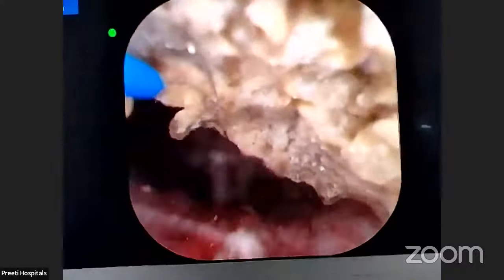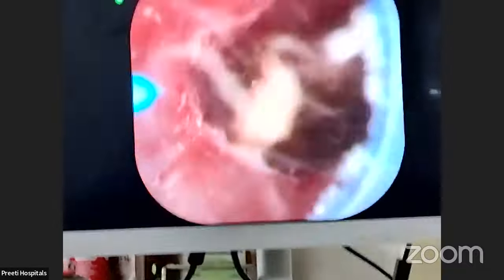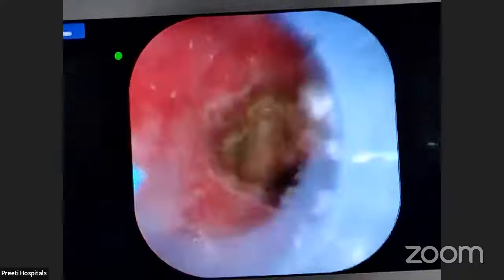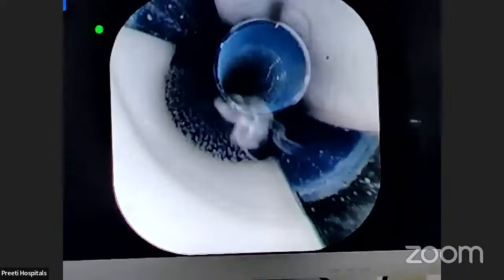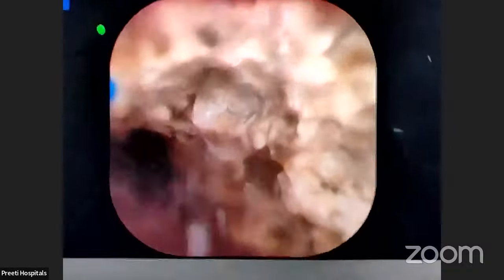And at the same time, in PCNL, if you feel that it is risky, see how they are coming out. Now I will come out every time, because this should be free. Otherwise, this scope and sheath get damaged. In fact, when the sheath was not going, I used a fresh sheath in this. You can push. See, I pushed the stone.